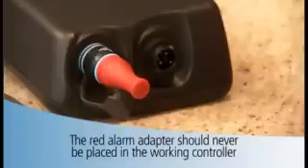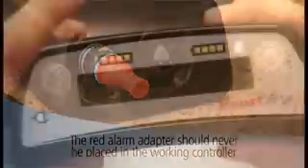The red alarm adapter should never be placed in the working controller. If a red alarm adapter is not available, you can silence the no power alarm on the original controller by pressing and holding the alarm mute and scroll buttons at the same time until a beep is heard, or for at least 5 seconds. Release both buttons, then disconnect the power. The original controller will be turned off and all alarms silenced. On the new controller, slide the white driveline cover over the silver connector.